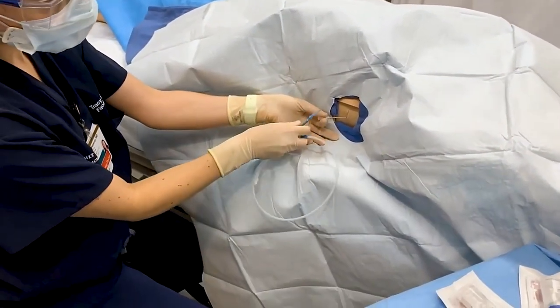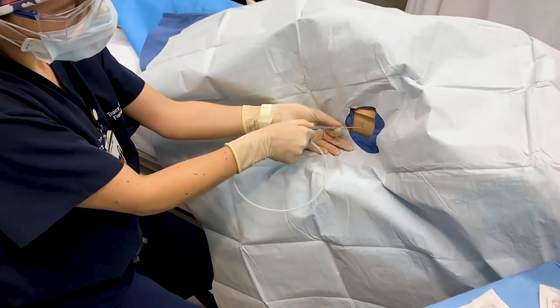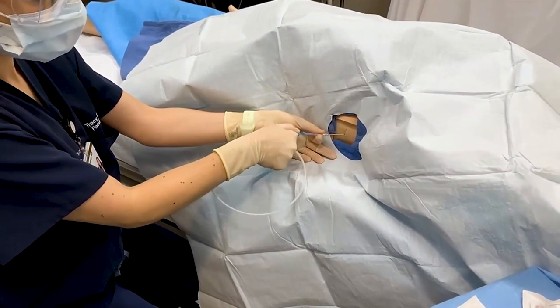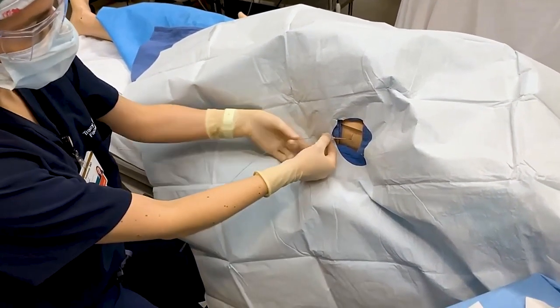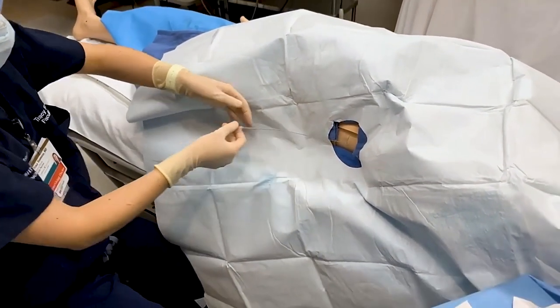Once you are now in the chest, take your wire and go ahead and thread it through your needle. Once your wire is in the chest, you can go ahead and remove your finder needle.